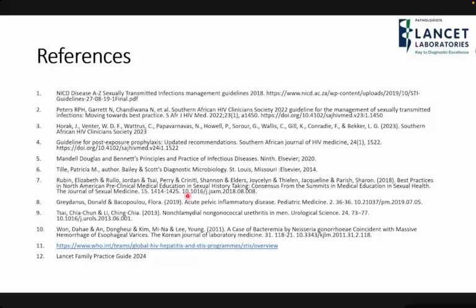But in state they have gel swabs, because state has cultures. I'm not sure about Albert Lutuli, but as far as I know, NHLS PCRs are only available in specific tertiary institutions. When I was training in CBICO, it was also difficult to get PCR molecular assays, and it would only be when you are asking for a favor and the clinicians are sure this patient has an STI and we haven't grown anything. We have laboratory derived tests that are verified and validated in the laboratory and are not commercially available. Sometimes we would send those samples to NICD as well for molecular assays.